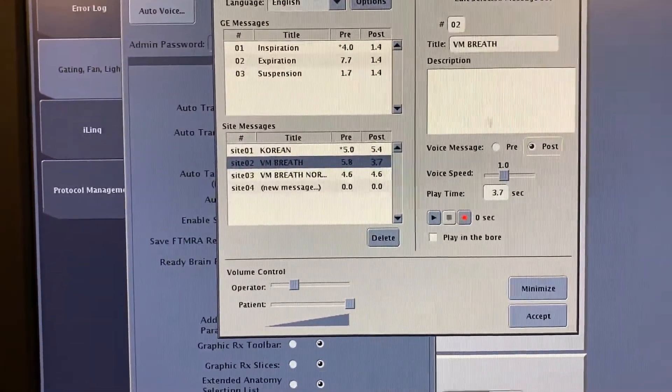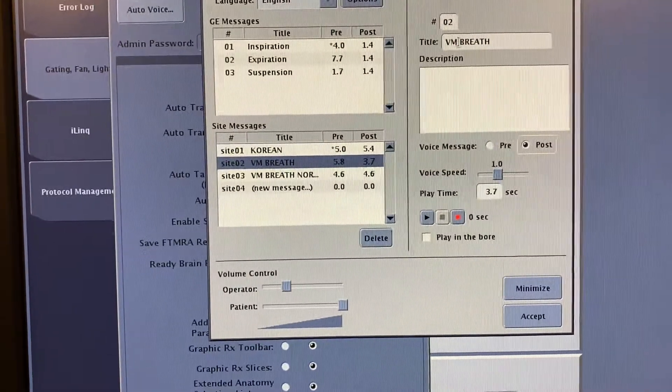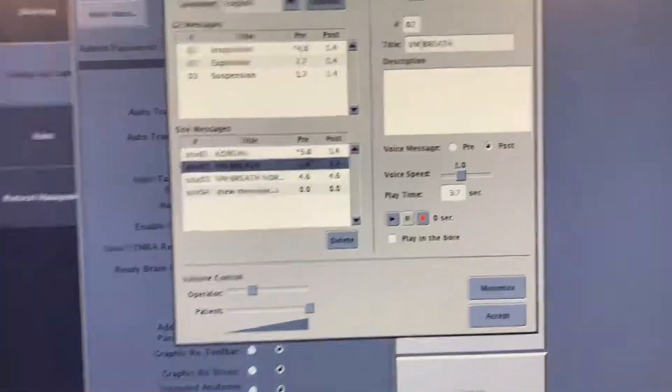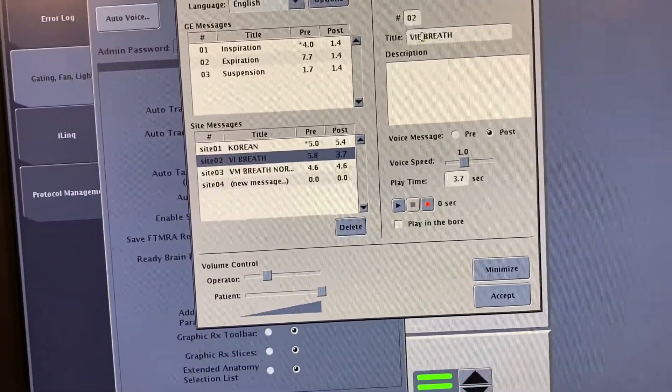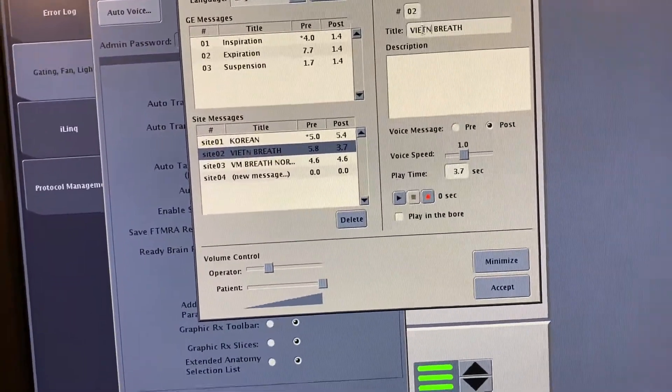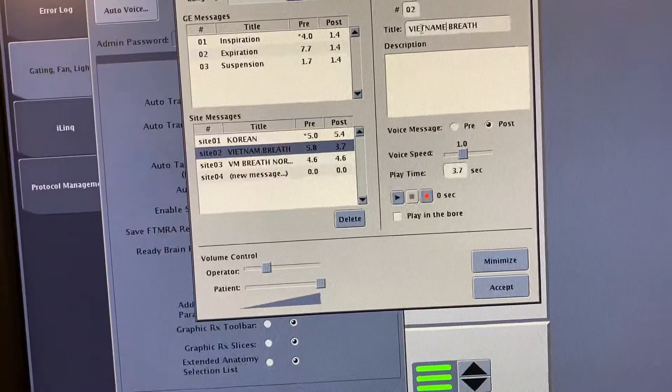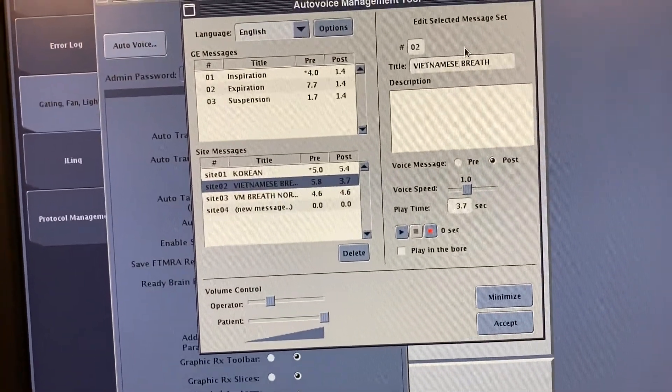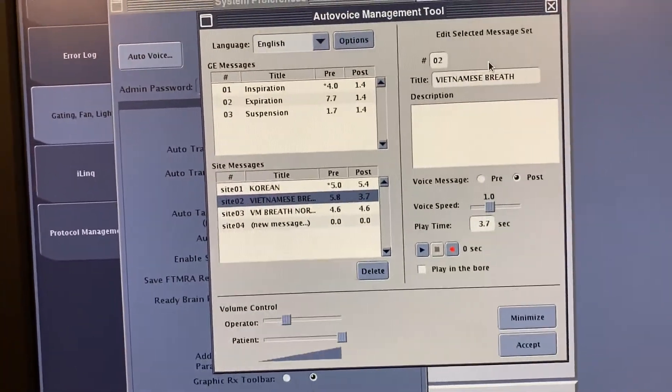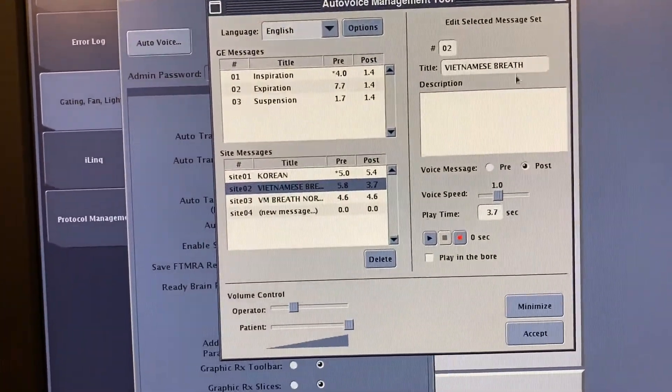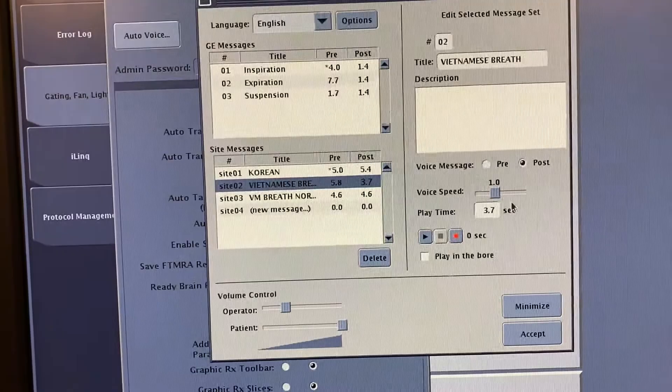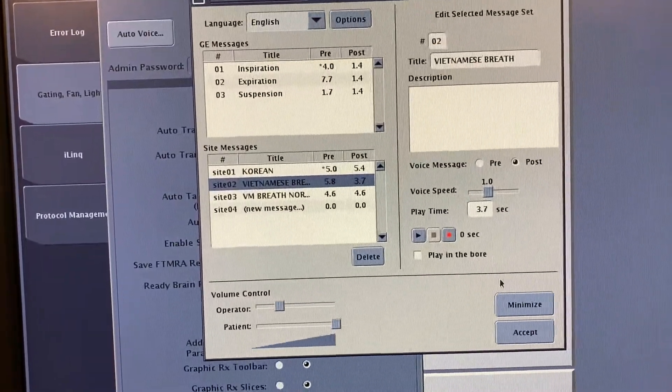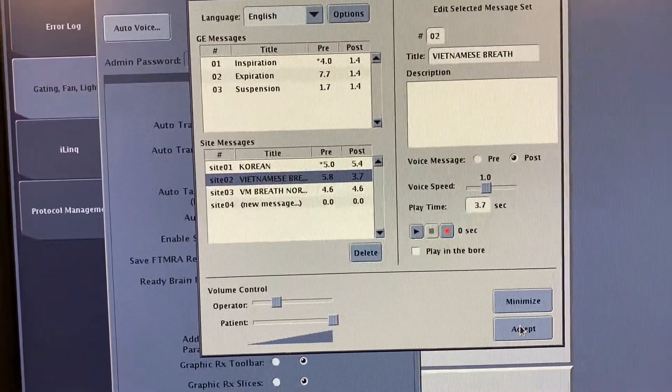I'm actually going to rename this one Vietnamese - Vietnamese so it's clear - Vietnamese Breath. Then hit accept.